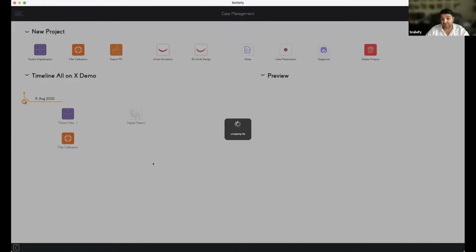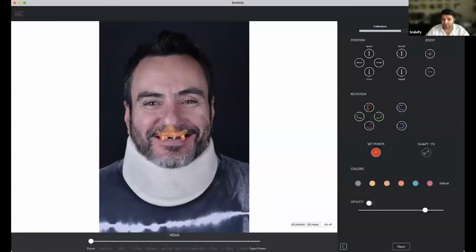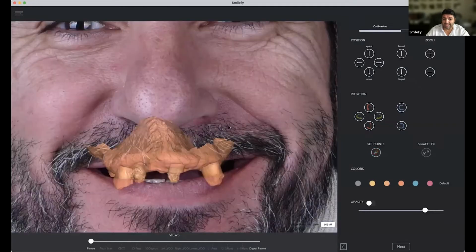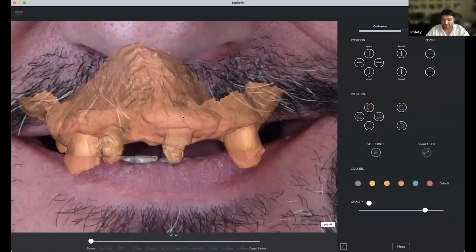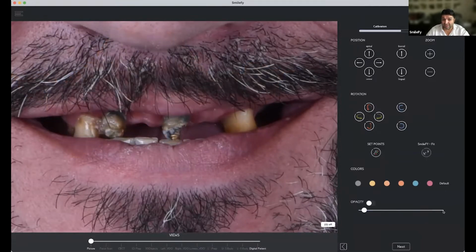When the patient's mouth is open, we have enough space to see landmarks in the intraoral scan and the landmarks in the picture, so that we can superimpose.